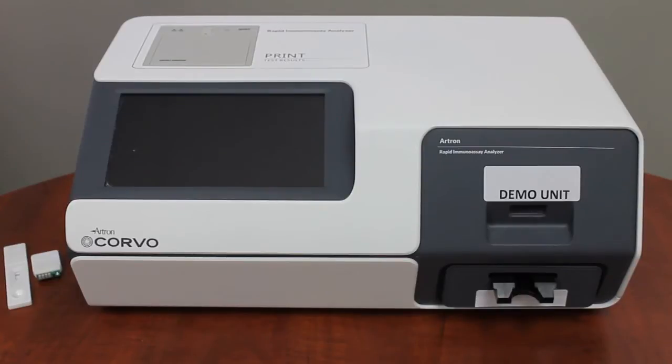Hi, my name is Stephanie and I'm here to introduce RTRON's new rapid immunoanalyzer, Corvo.